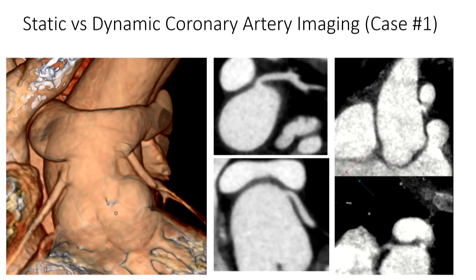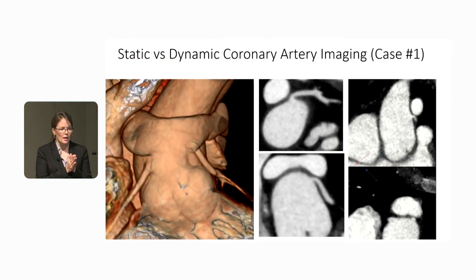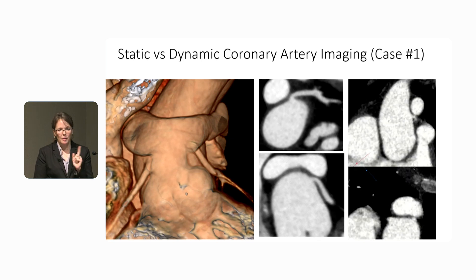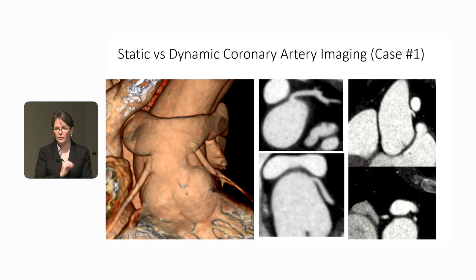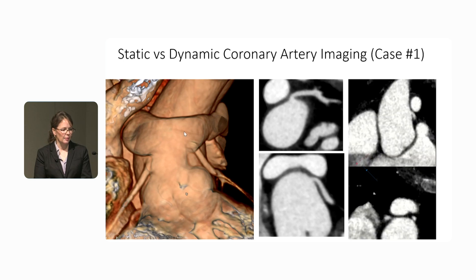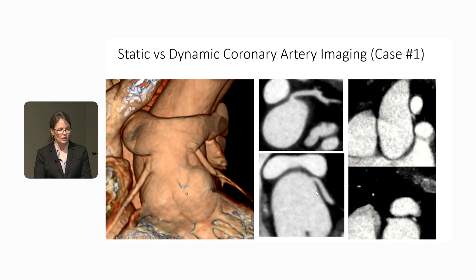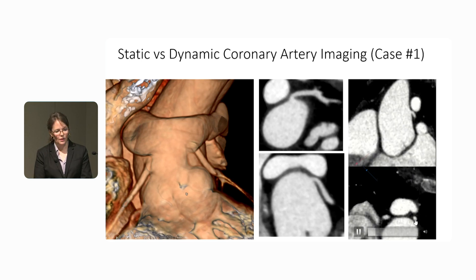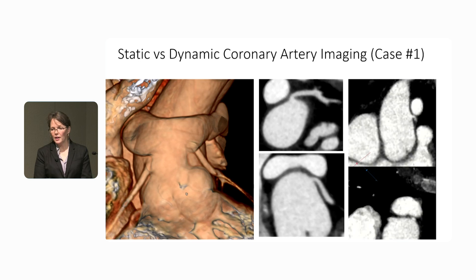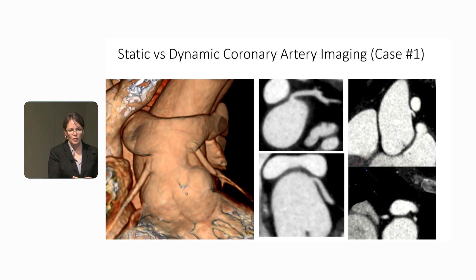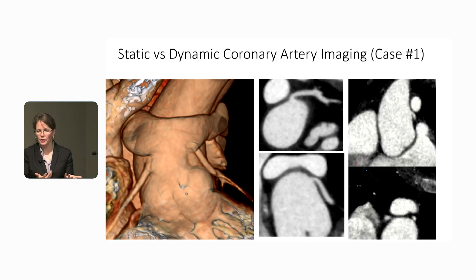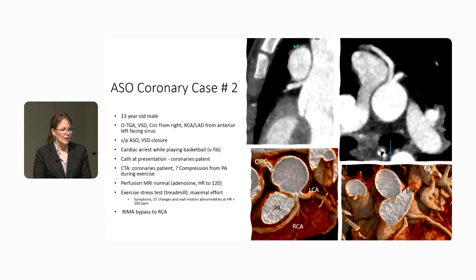Typically when doing a coronary image, you look at the single interval that gives you a picture of the coronary artery. For patients with exertional symptoms, we've actually done functional CT. Here you can see the LeCompte pulmonary arteries anterior to the aorta and the re-implanted coronary arteries — the re-implantation is beautiful. But look at this: during the cardiac cycle, with systole the coronary is between the aorta and the pulmonary artery, and with maximal exertion when you have systemic PA pressures, you can start to get compression similar to an anomalous left coronary.